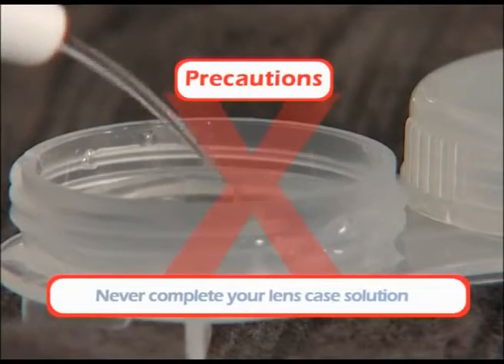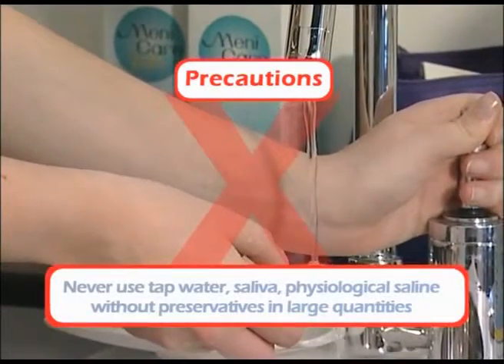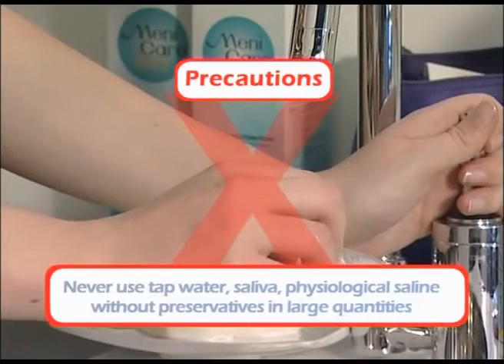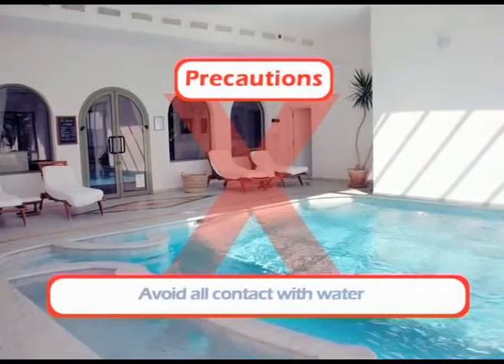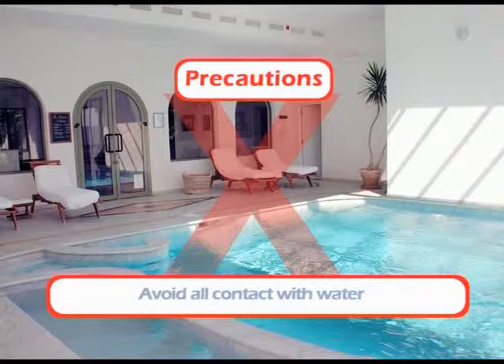Never add new solution to remaining solution in your lens case. Never use tap water, saliva, or physiological saline in large quantities without preservatives to rinse or preserve your lenses. Avoid all contact with water — wearing your lenses in an aquatic setting such as a pool or river is not recommended.